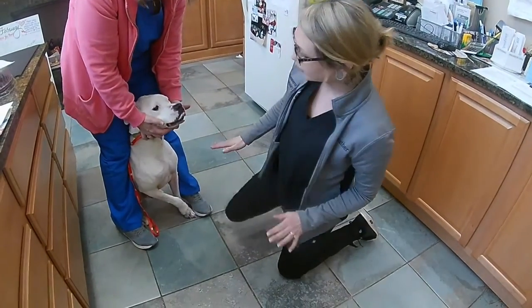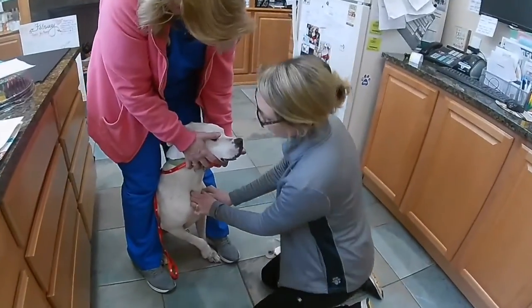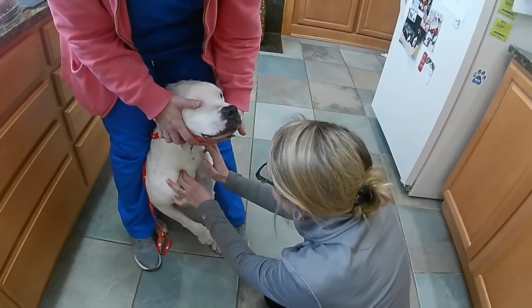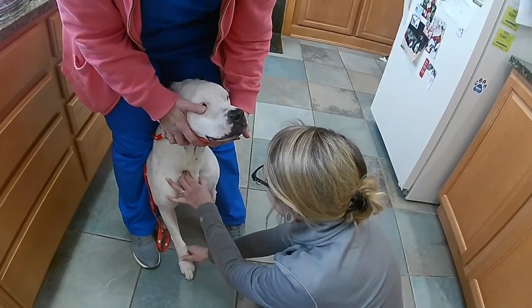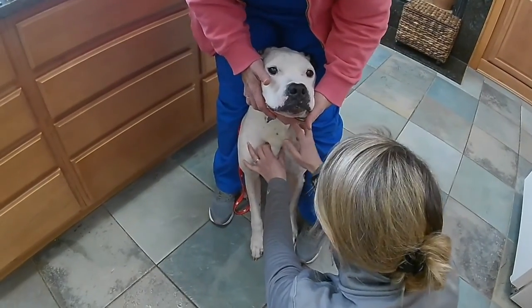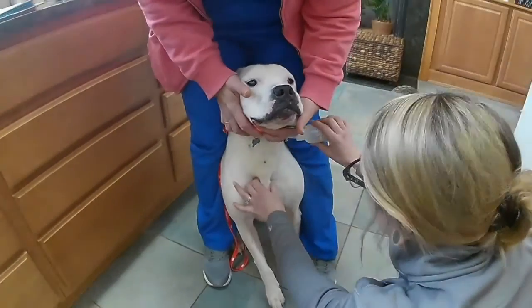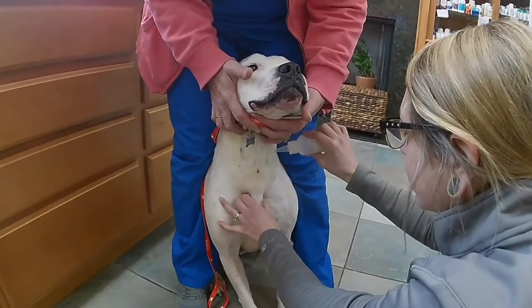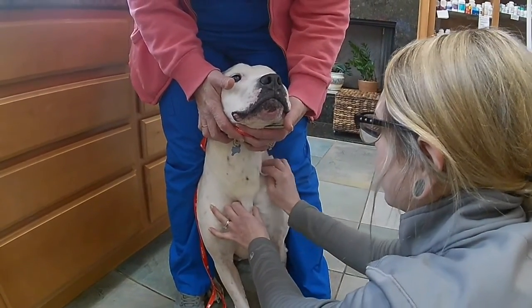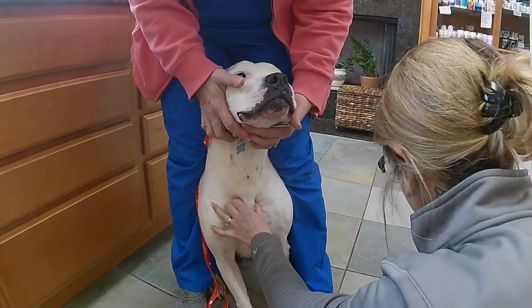So initially, I'm going to hold off in his thoracic inlet in here, and I'm just going to get familiar with his neck and find out where that is, and see if we need to adjust any positioning, which I do feel it right here. So then I'm going to cleanse that area. I'm going to put some alcohol there. I'm going to wipe him down a little bit. And then I'm going to get ready.